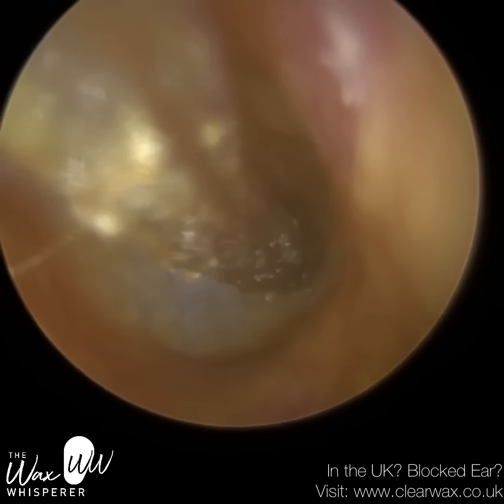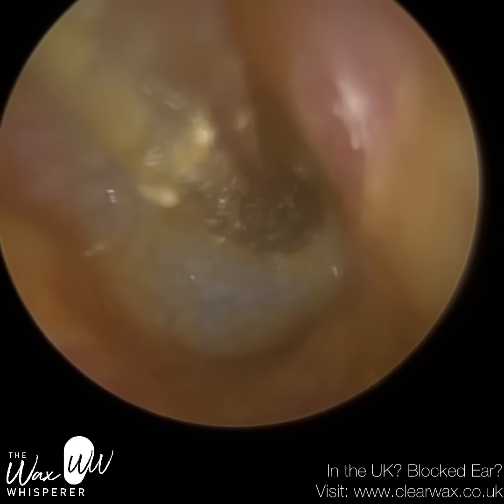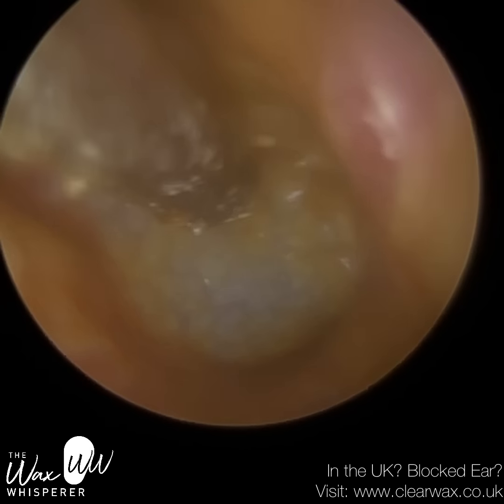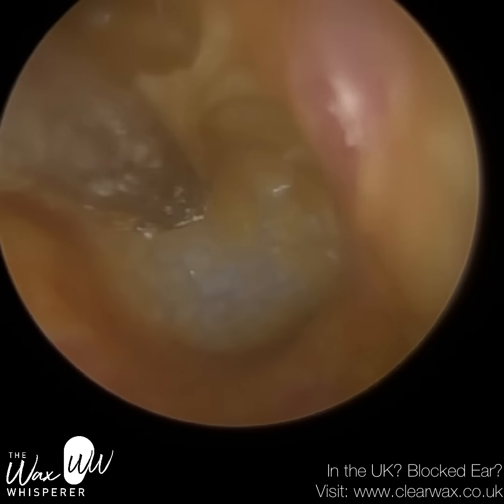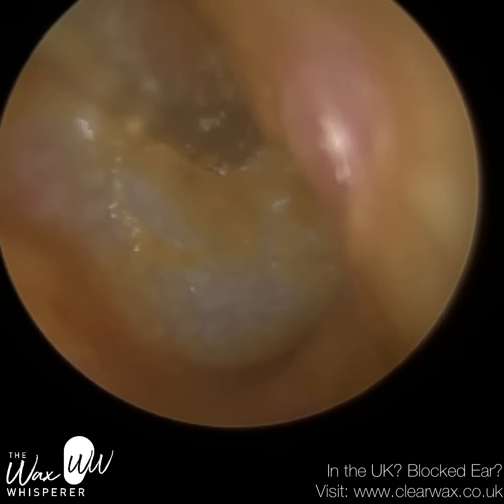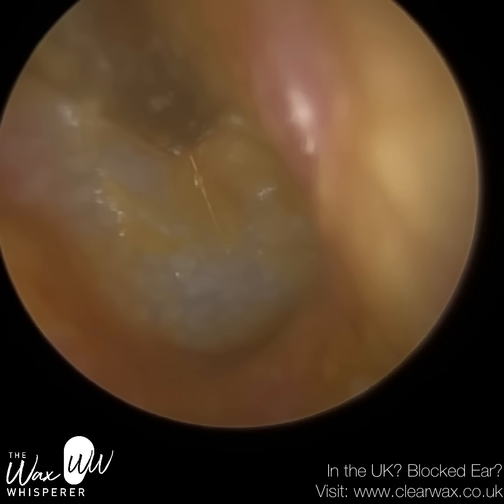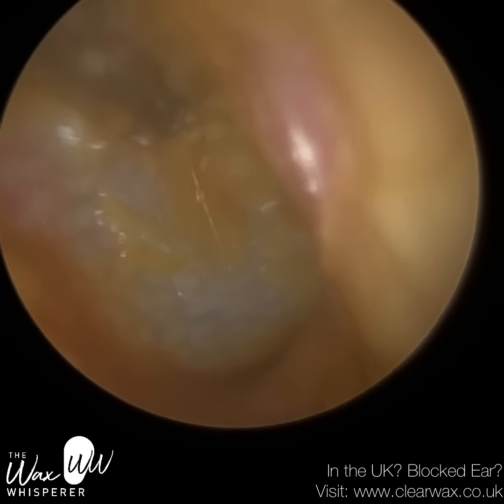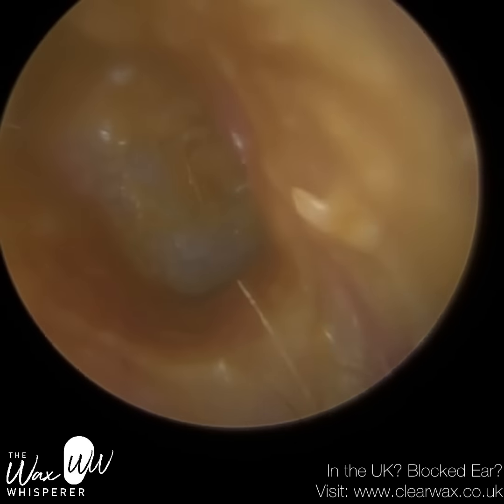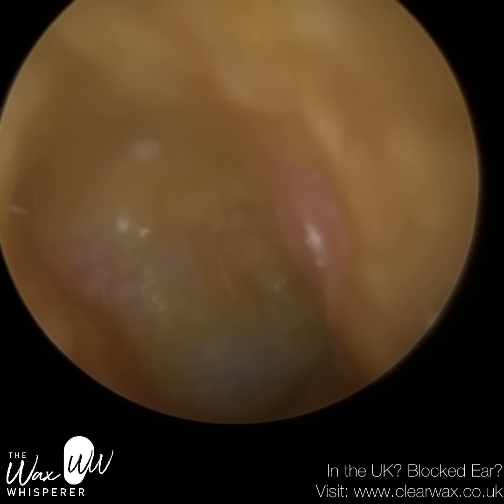And in an attempt to remove the debris off the eardrum in that region with the full sucker, I actually grazed the side of the ear canal. You can just see that. So what I've had to do now is revert to a fine end. You may have just seen there with the fine end, I've made a little bend, a little kink, so I can curl around the front part of the ear canal so I don't make contact with it. Fortunately, the patient didn't feel it at all, but if I made more of an impact, I could have bruised that part of the ear canal. It would have been a bit uncomfortable for the patient.